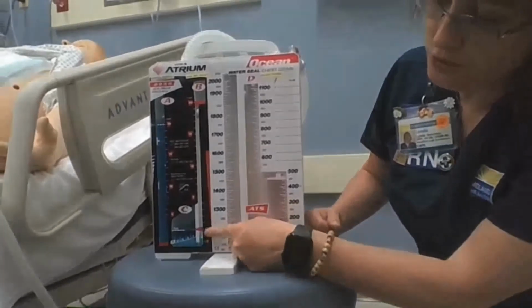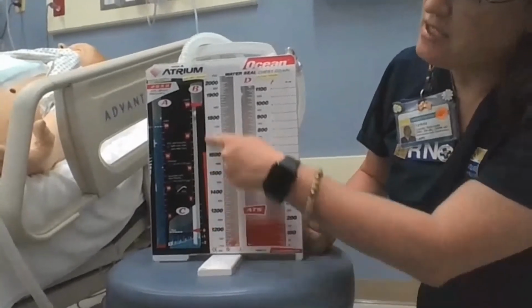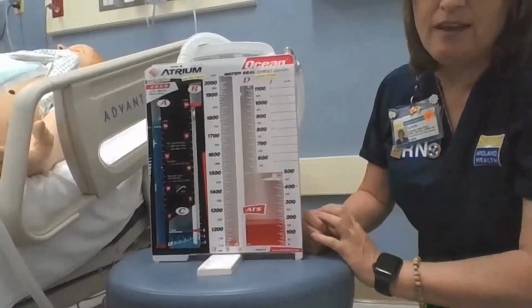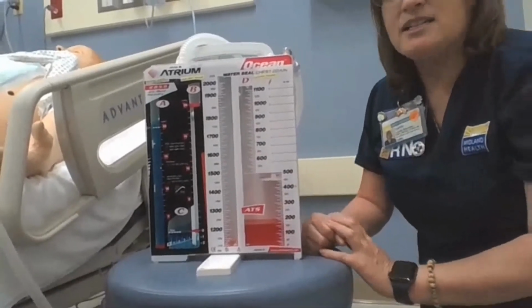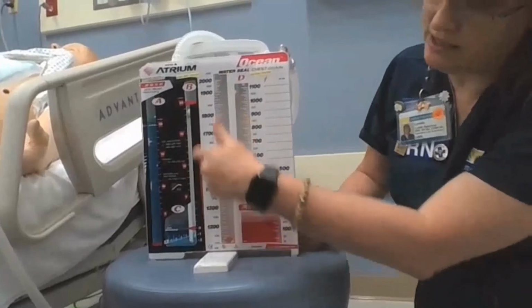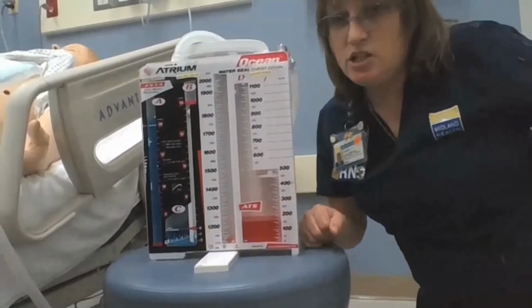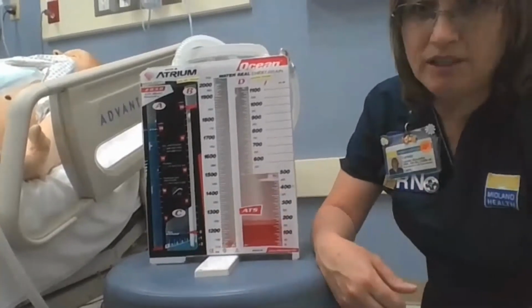Now, the little ball should be between 0, +1, and +2. If it rises above 0, this here measures intrathoracic pressure. So if it rises above 0, that is a call to your RT and to your physician. There is nothing from a nursing standpoint that we can do here. There should never be any bubbling in chamber C. So chamber C should look just like this, with no bubbling.